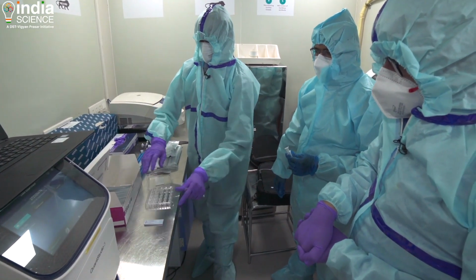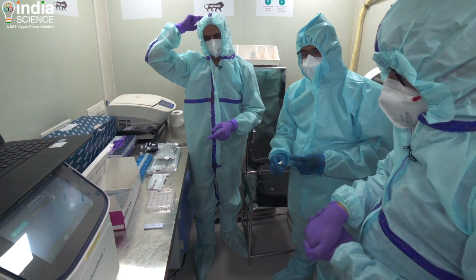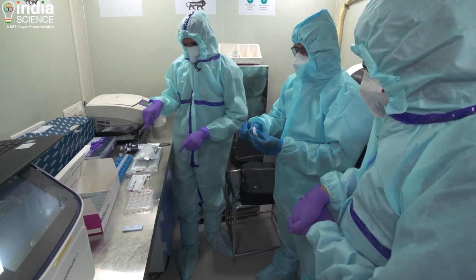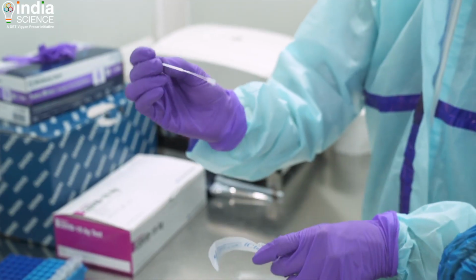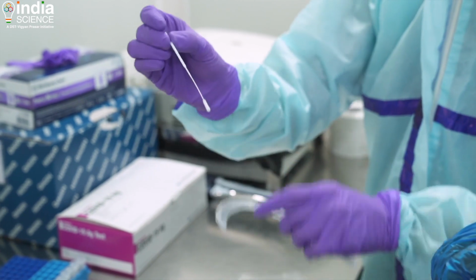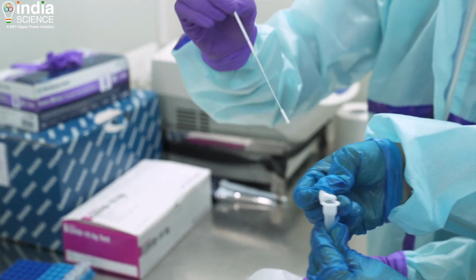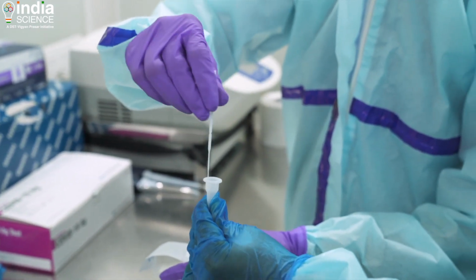So we set it up here like this, and then we need samples. Again, it is done with a freshly isolated VTM sample. So you need buffer. The buffer is inside, right? Yeah, buffer is inside. So sample is collected with this nasopharyngeal, this nasal swab. This is inserted into the nasopharyngeal area, and then you put it into this, which has an inactivation buffer.